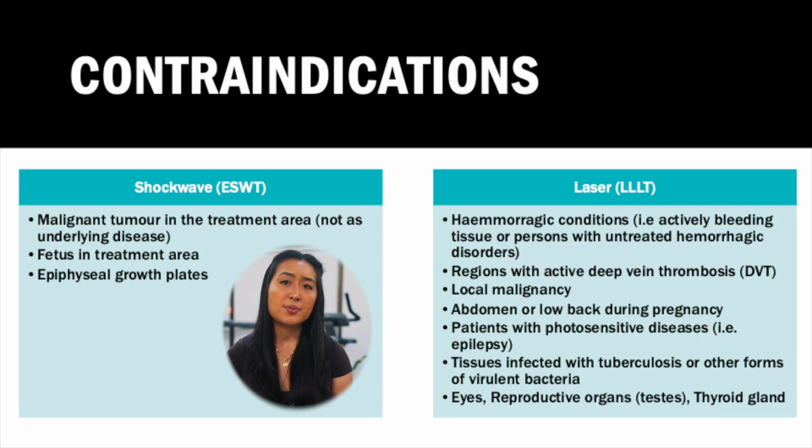With contraindications, most of these are quite obvious. For shockwave therapy and for laser therapy, we would not use it for any treatment areas where there is any local malignancy. One thing to note is that shockwave therapy is deemed to still be safe when cancer is a concomitant disease. Other contraindications include pregnant women. We don't want to be using either modality in the abdomen or lower back in women who are pregnant. We also would never use shockwave directly on the epiphyseal growth plates for kids who have not gone through puberty and have finished with their growth spurts, as the shockwaves could have an effect on their growth.